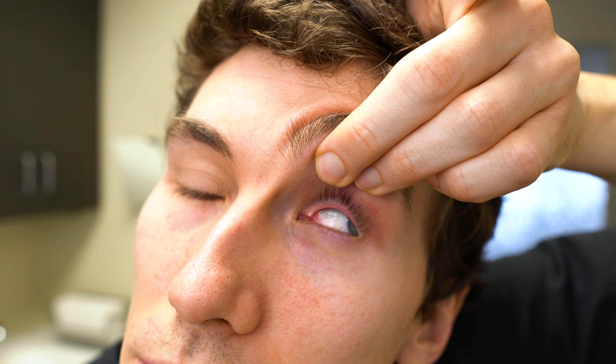If you've ever had a contact lens stuck on the eye, or maybe a lens stuck underneath the eyelid, then this is the video for you. We're going to walk through some tips on how to remove a contact lens that's stuck on the eye safely.